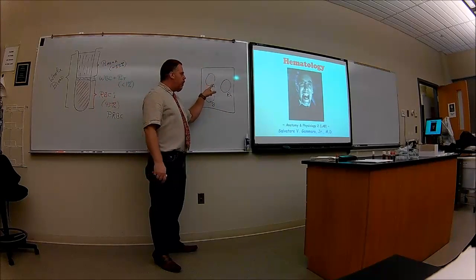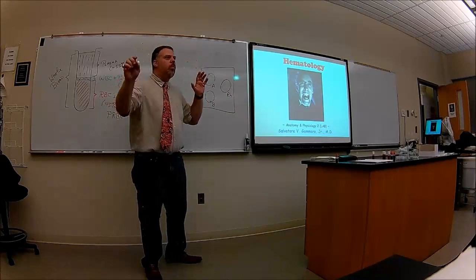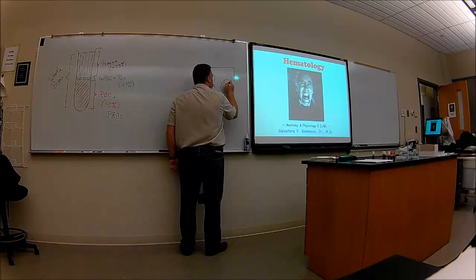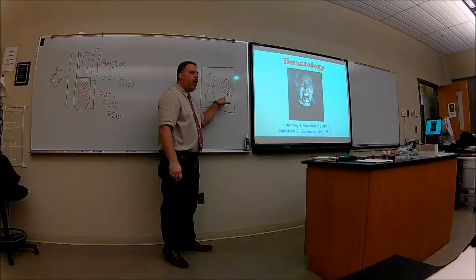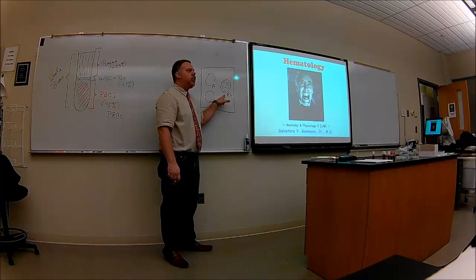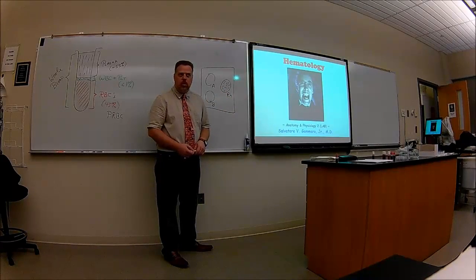Whatever blood you put in the other wells, you're now going to put a drop of that same blood in here. With the Rh antibodies there, you're going to see clumping. In this particular case, you'll have to see clumping. What can you tell me about antigens in this well only? There are Rh antigens there because the antibodies cause clumping, or agglutination. Does that make sense?